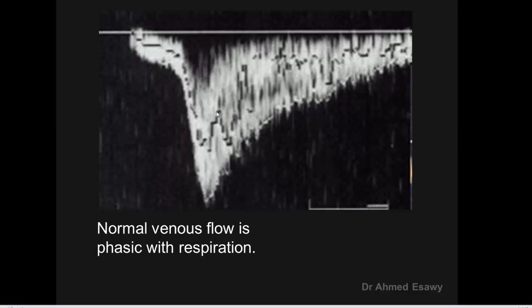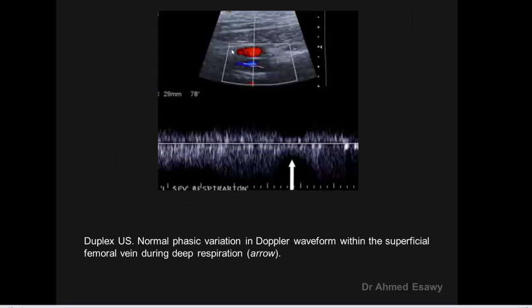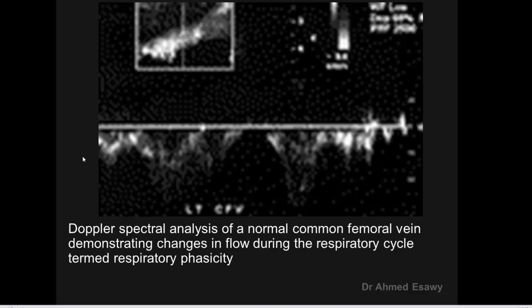Venous flow velocity increases with expiration and decreases with inspiration. Examples of phasic flow: normal phasic variation of venous flow in the superficial femoral vein during respiratory variation — increase in expiration, decrease in inspiration. Spectrum analysis of the normal common femoral vein shows respiratory variation of phasic flow.